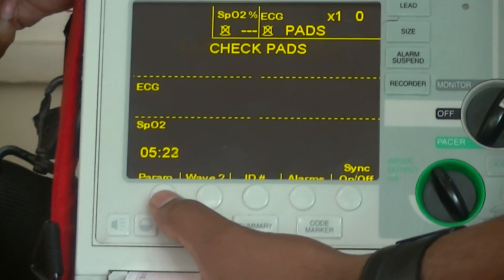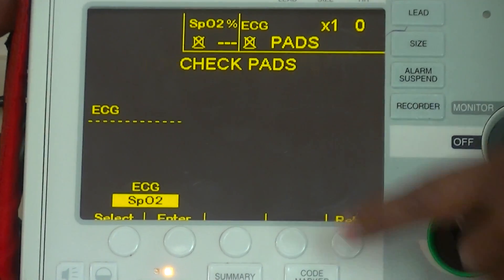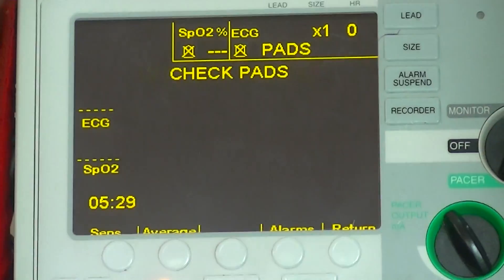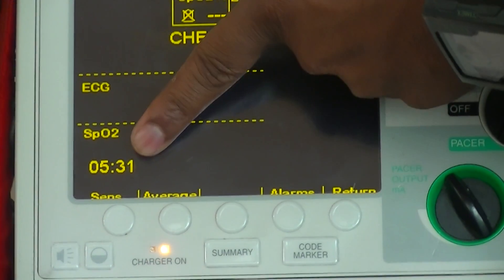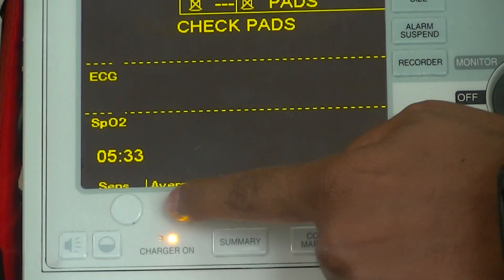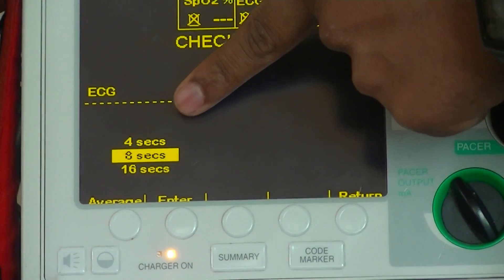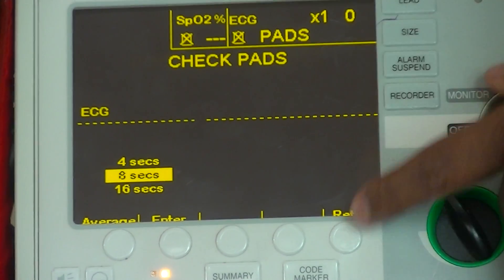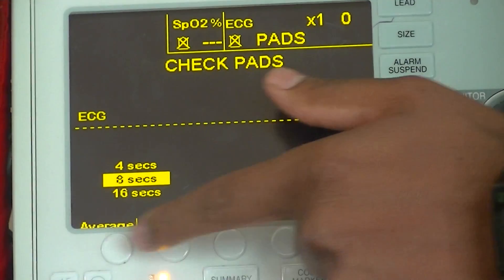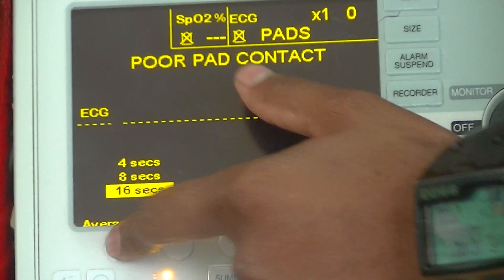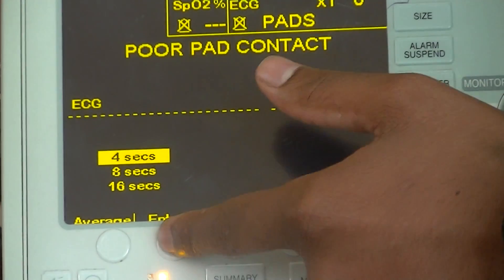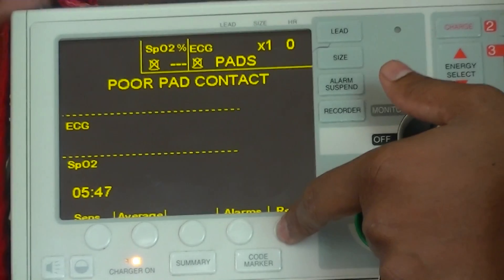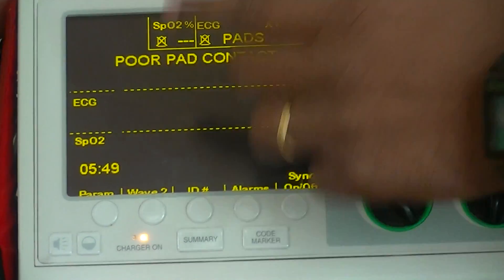The parameters option shows ECG and SpO2. By selecting this, you can choose how much sensitivity you want, and the average sensing time — whether you want to sense every 4 seconds, 8 seconds, or 16 seconds. Once selected, you can enter and it will be set. Every 4 seconds it needs to be set, and it goes back. Then press return and it goes back to the main screen.